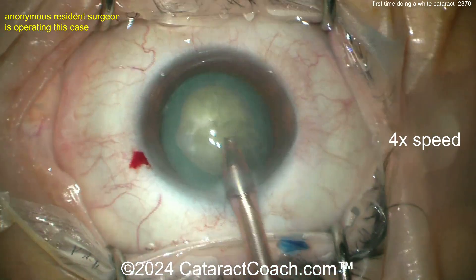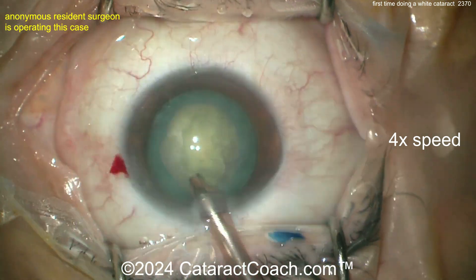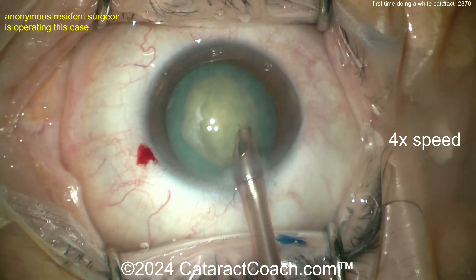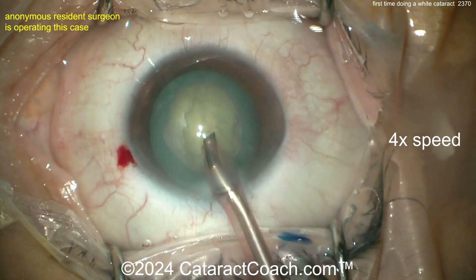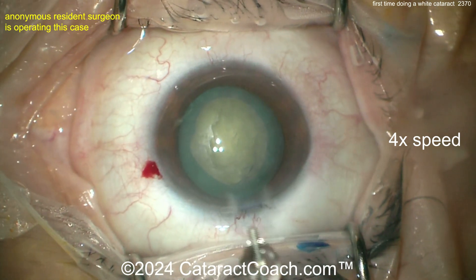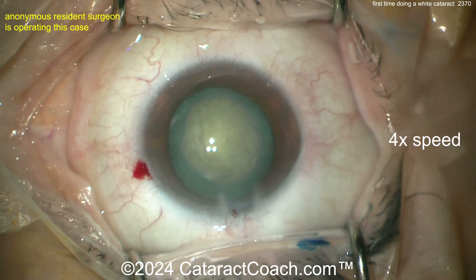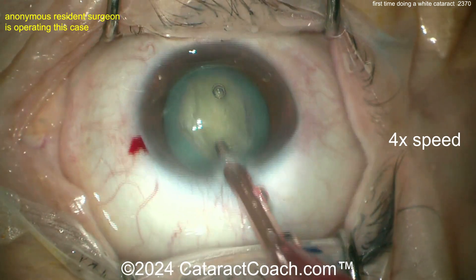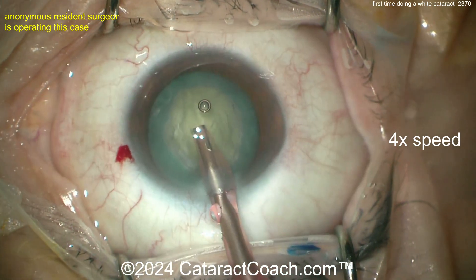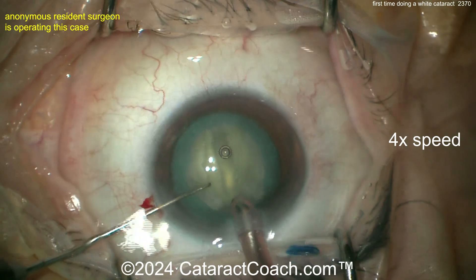Get that eye back in primary — there we go, that's better. The surgeon is sitting superiorly; you can certainly operate temporal or superior, whatever makes you happy. The probe comes out of the eye — not sure why — and then more viscoelastic goes in. Maybe that was hydrodissection or additional viscoelastic. Now the phaco probe is back in the eye with a spatula or paddle in the other hand.